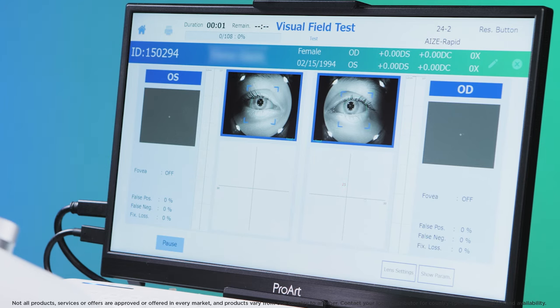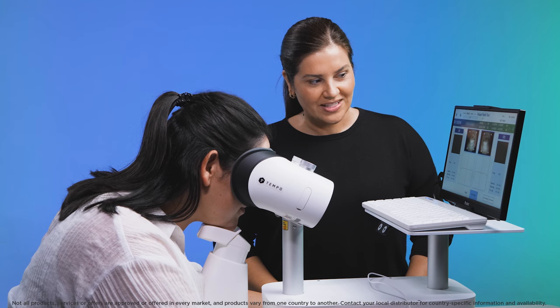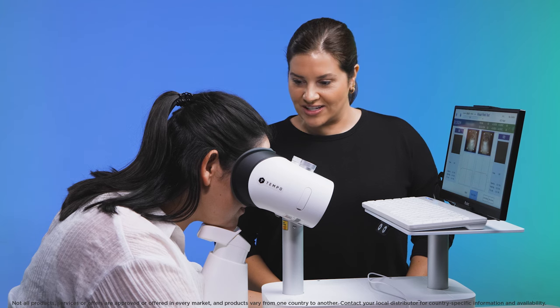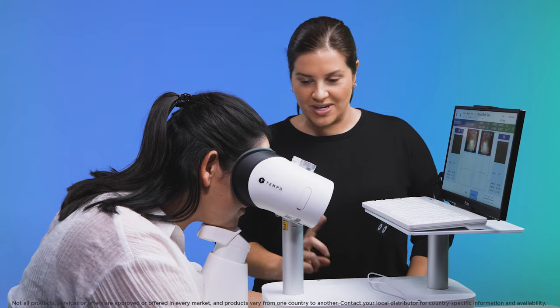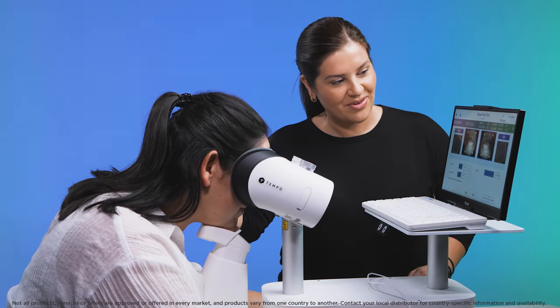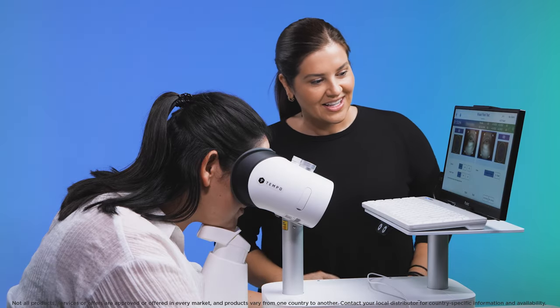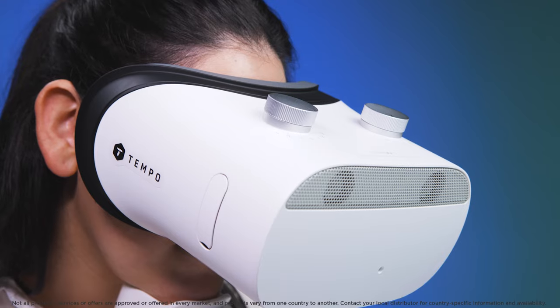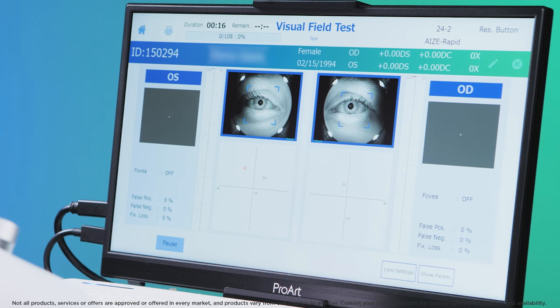Once under way, stay with the patient and keep reminding them to focus on the central cross. Monitor their position to ensure they remain aligned and do not move backwards. The patient should focus on the cross during the test and should be reminded not to move their eyes or follow the lights as they appear.